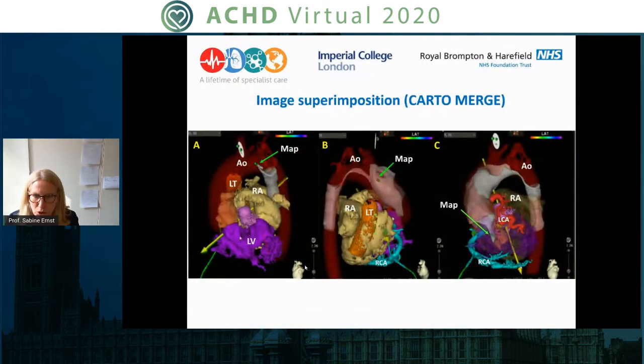We typically merge, and this is an example of it, in the EP study over the virtual location of the ablation catheter. You can see that here is a gray volume, and that is merged over the aorta. The aorta doesn't move much. And that's essentially the trick of how, in even the most complicated hearts, in combination, in this case, with magnetic navigation, but you could do it in a conventional procedure as well, we move around essentially in the virtual 3D heart of any given patient.